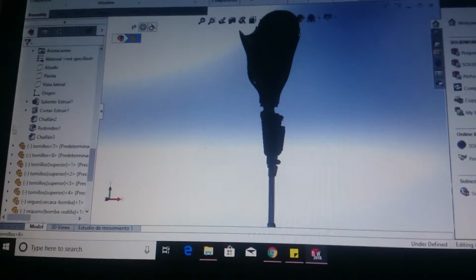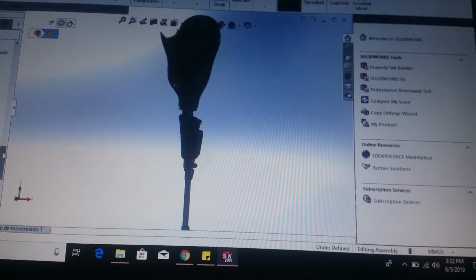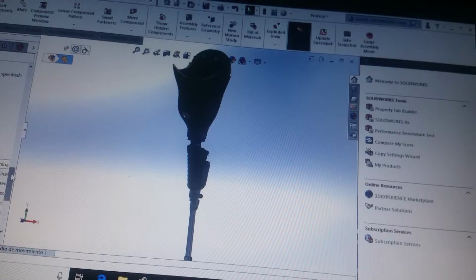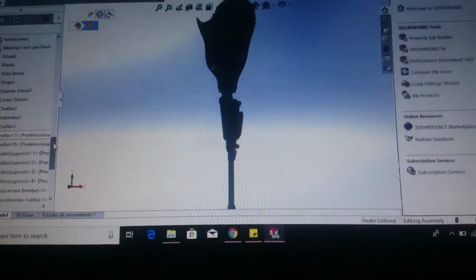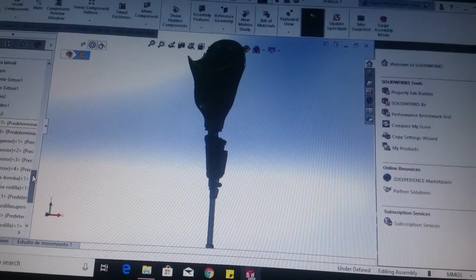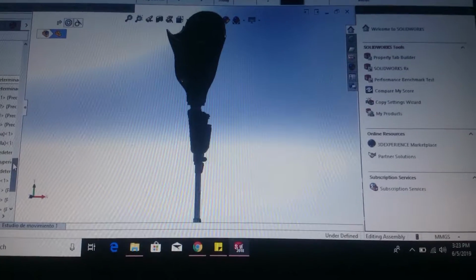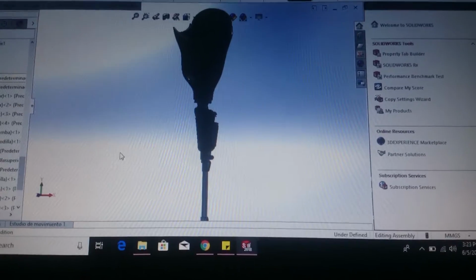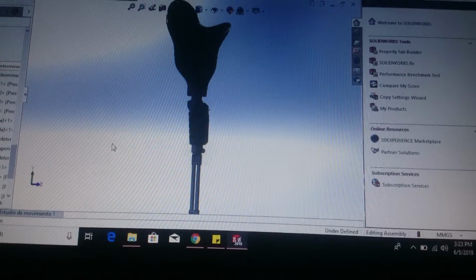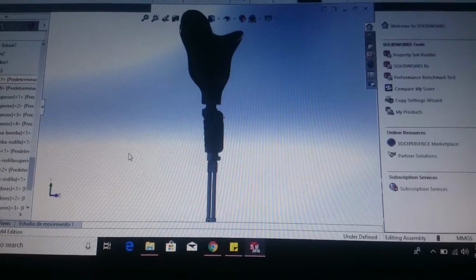The treatments in diseases that the prosthesis of the lower limb covers are cancer, amputation, muscular disease, muscular atrophy, myasthenia gravis, lateral sclerosis. The limitations of the leg prosthesis are a bit complicated, and one of the challenges they face is that they support the weight of the body, so they have to be hard enough to support and flexible enough to be able to move.